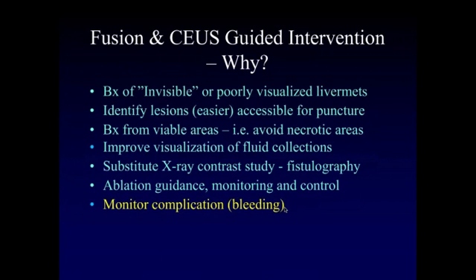Finally, I want to call your attention to the fact that we can also use CEUS in the monitoring of bleeding, and bleeding may be a complication to our interventional work. It can also be in the trauma center, but CEUS is very good for monitoring bleeding.